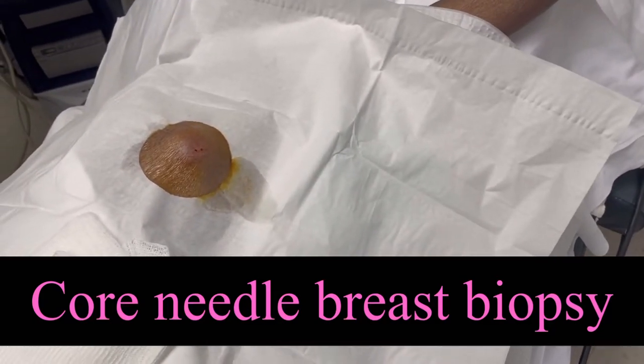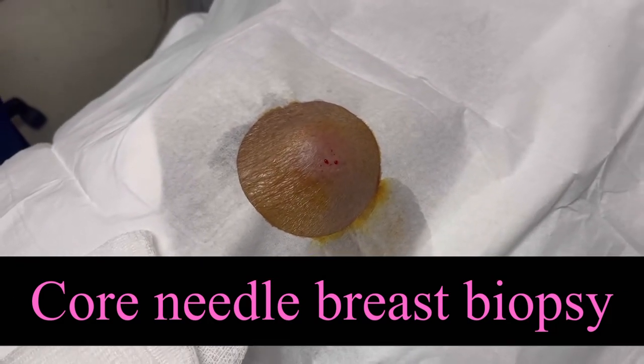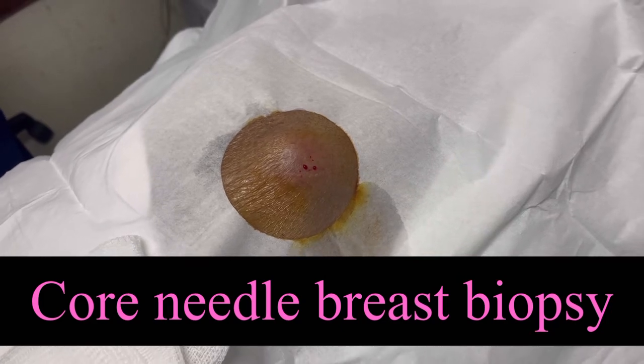This is for left breast biopsy. BIRADS for a 2.9 centimeter mass on the left side, axilla.